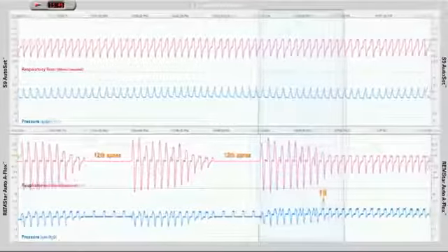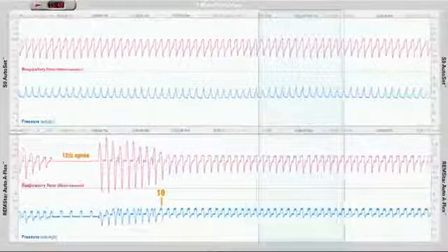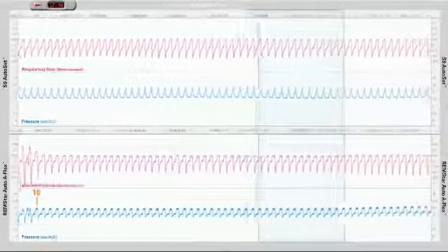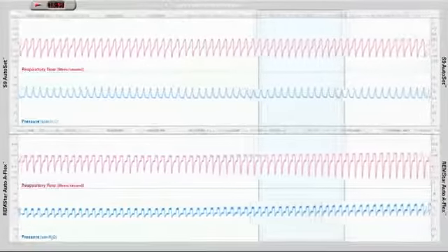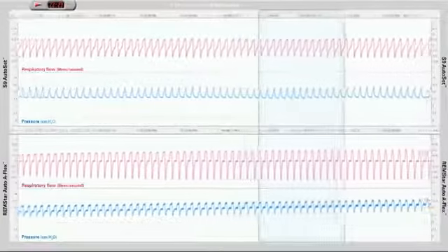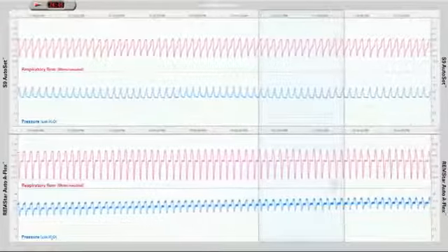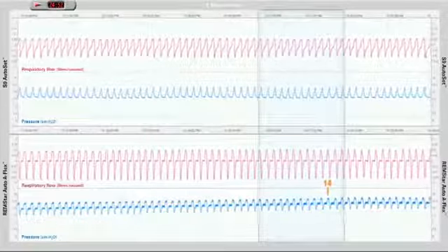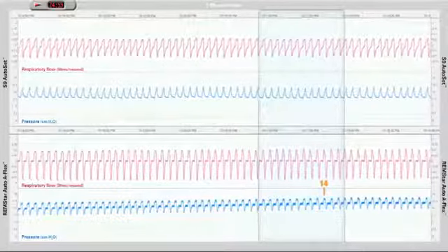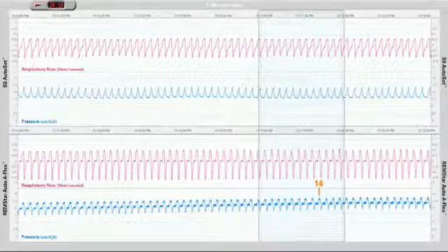10 centimeters. At a treatment pressure of 10 centimeters, there is still evidence of flow limitation in the breath shape. It takes a further 12 minutes for the REMstar Auto to reach a final treatment pressure of 14 centimeters and eliminate all evidence of flow limitation. By this time, the S9 AutoSet patient has had a stable airway for over 22 minutes.